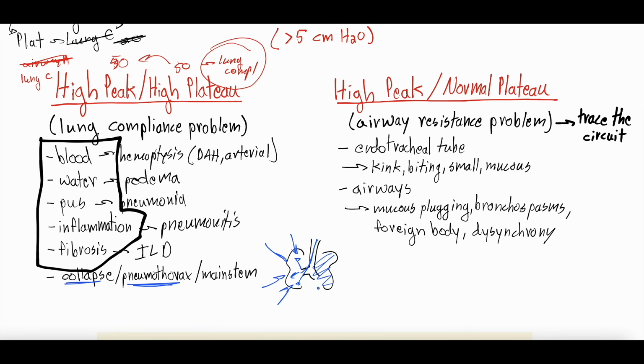Or if you have had a pneumothorax, a popped lung, let's say this lung's totally collapsed because there's a pneumothorax. Again, you're just ventilating one lung. And the amount of tidal volume is the amount of tidal volume, right? Let's say you set the tidal volume at 500. That tidal volume is supposed to go into both of the lungs, right? And if it's only going into one of the lungs, so instead of getting 250 and 250, this lung's got a pneumothorax and is collapsed down, that means now you're trying to put 500 cc's of tidal volume in that one lung, and you're going to over-distend it. You can think of it like a balloon again, right? If you're pushing 250 cc's into a balloon and then try to push 500, that pressure, that compliance that it's coming back down with is going to be more robust.